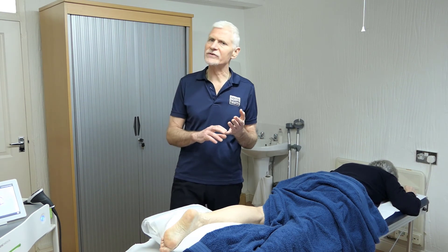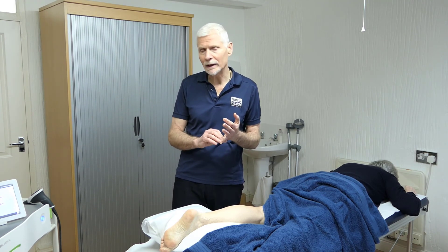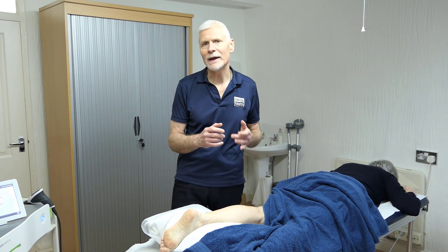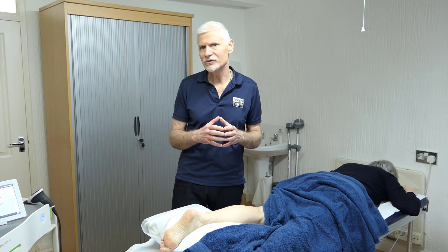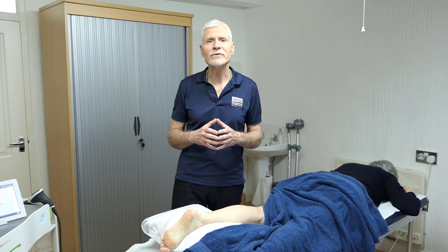Shockwave therapy has been shown to be particularly effective for chronic tendinopathies, and is most commonly used for the Achilles, for plantar fasciopathy, for patellar tendon pain, and also for greater trochanteric pain syndrome — that is, pain around the greater trochanter of the femur. And that is our shockwave therapy.